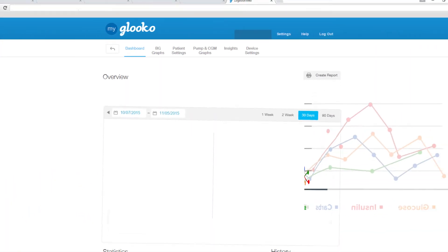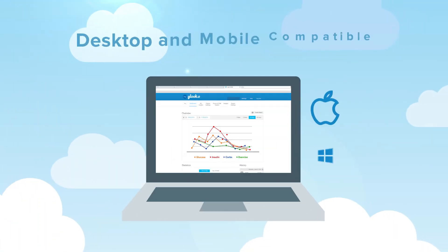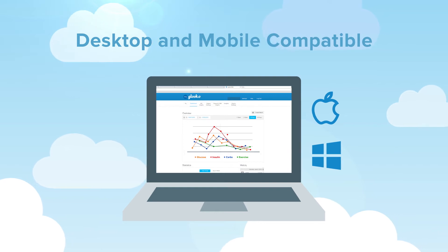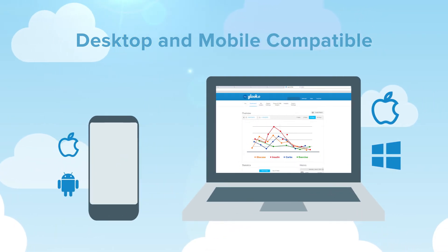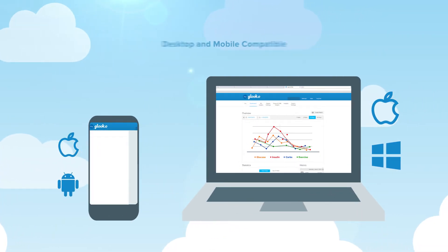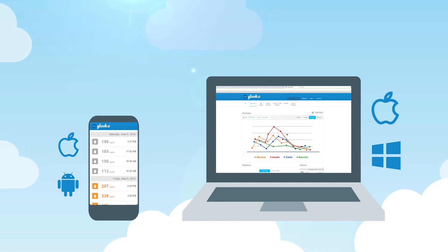Insulet-Provided Glooko can be used on your Mac or PC computer and iOS or Android mobile device. Now, you can see all of your data at home or on the go.